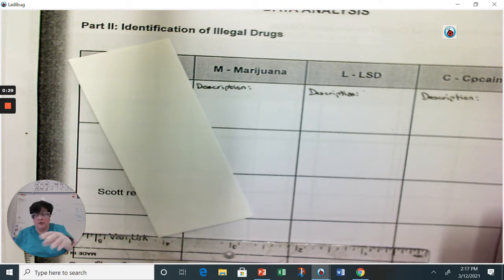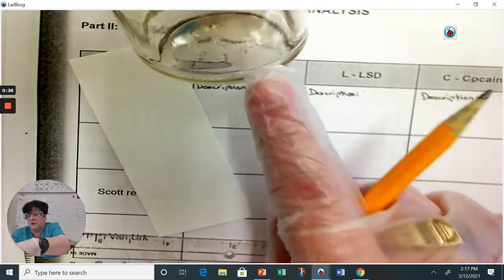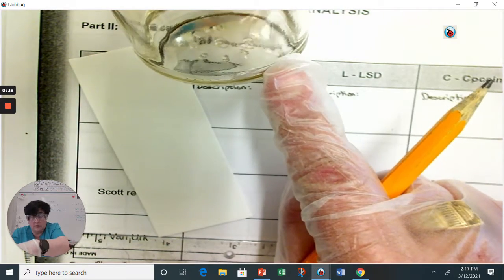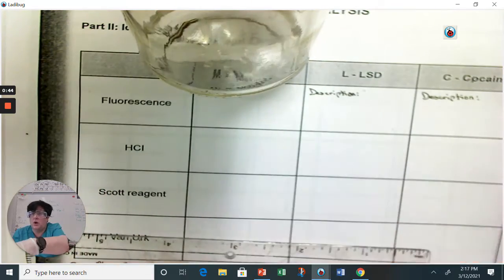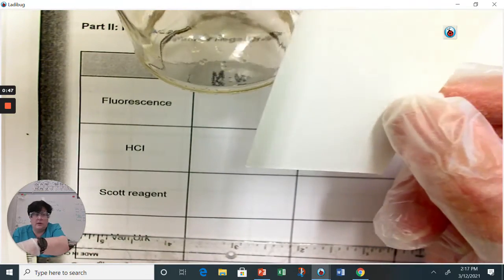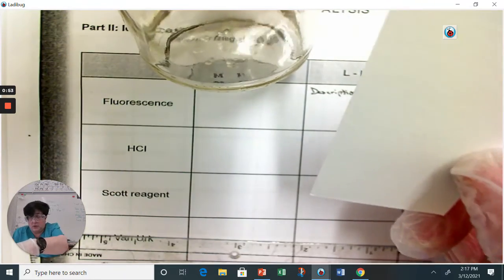So we are at this chromatography chamber, right? It's a glass jar with a cap. I've put into it what is called chromatography solvent. So this acts by a wicking action in an interaction of the solvent with your chromatography paper, and also with the material you put on the chromatography paper.